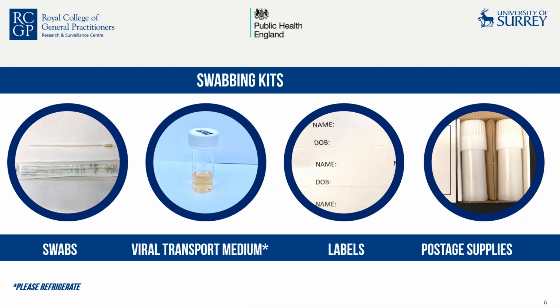Now, this slide just covers what the swabbing kits contain. The lab has informed me that you should receive the swabbing kits by the 3rd of October, so next week on Thursday. You can start swabbing as soon as you receive the kits. You will receive the swabs, the viral transport medium. Please refrigerate this as soon as you receive it. This comes in a small box that's the size of a lunchbox and shouldn't take too much space in your fridge. You'll also receive sticky labels and packaging, which includes pre-labeled envelopes.